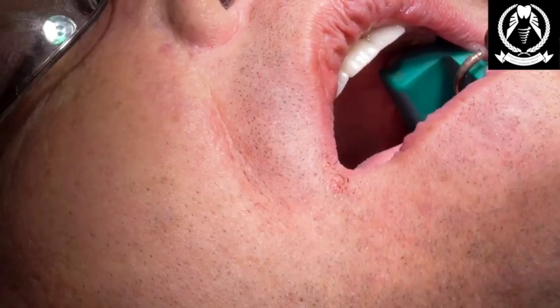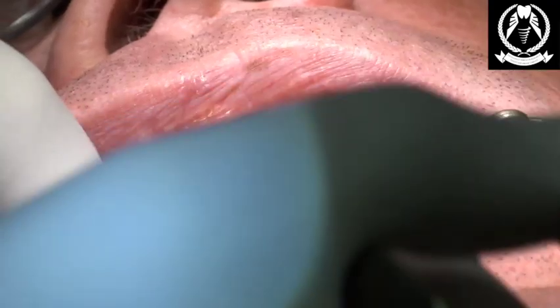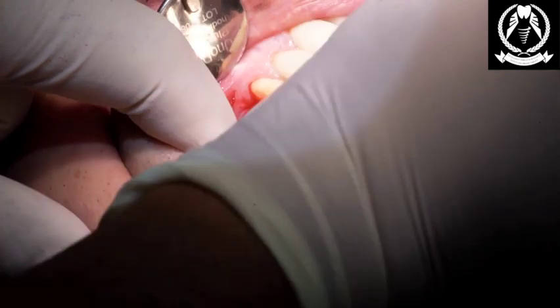Awesome. And we're just going to take the second one now. Let's get this fella. It's live extraction on TV. Okay, let's give that a little rotation. See if that wants to play.